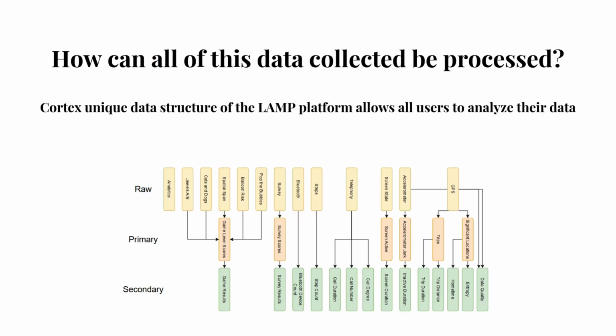Now that you've seen how all this data is collected, here's a quick visual summary of how the data is stored and processed. The Cortex data analysis pipeline is designed to easily hook into the database and extract important and clinically useful secondary data features, such as sedentary behavior, time spent at home, device screen usage, sleep estimates, and much more, from the terabytes of raw data. It can trigger custom, just-in-time adaptive interventions and produce useful interactive visualizations viewable by patients and clinicians.